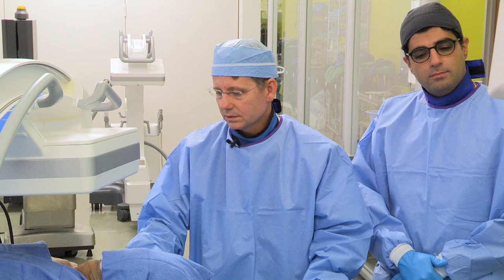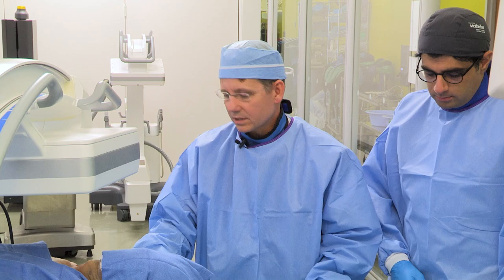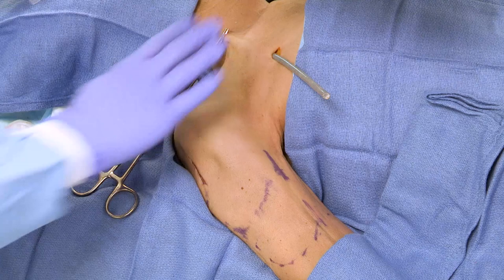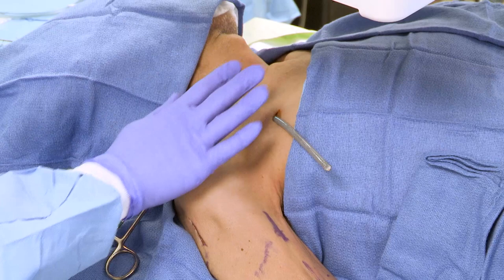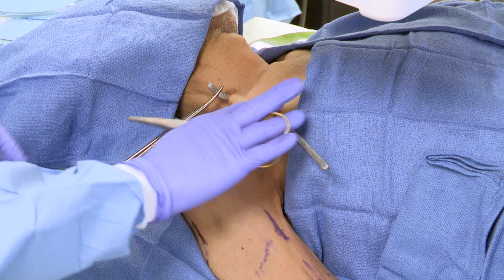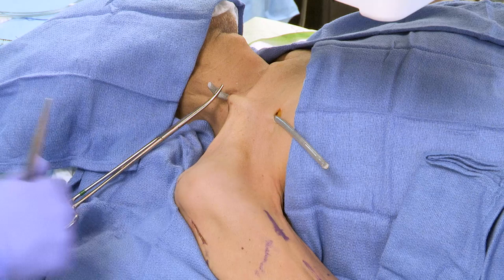We'll start with the outflow component by doing a cut down on the neck and look for where the catheter is at and entering the jugular vein. Typically at this point we've left the exit site of the tunnel dialysis catheter covered so that it's not exposed to the rest of the field. We'll then take some heavy scissors and fully transect the catheter. We don't mess with this part at all until the rest of the procedure is done, so that we don't have contamination from the exit site to our new hero graph device.